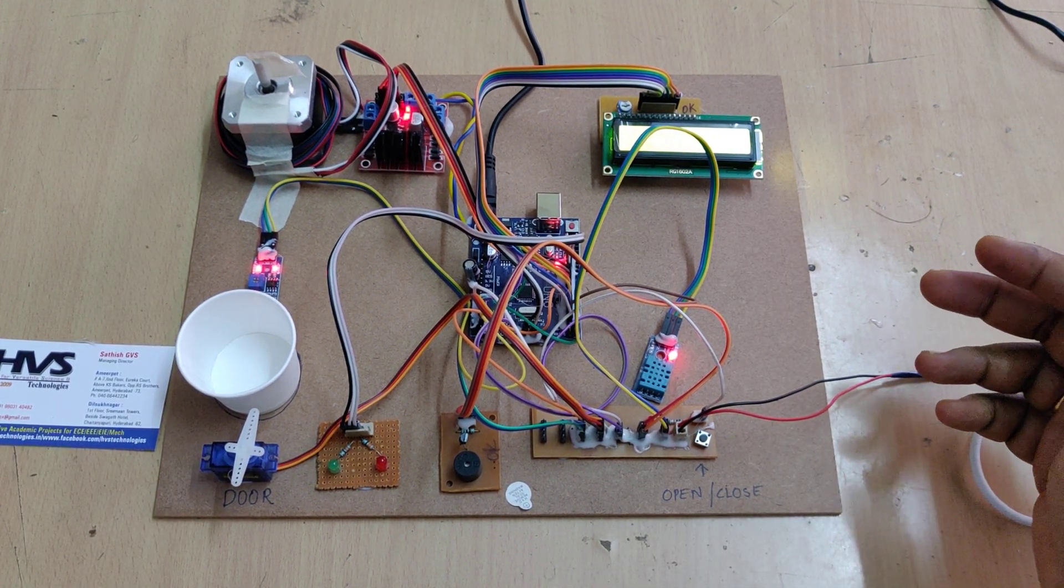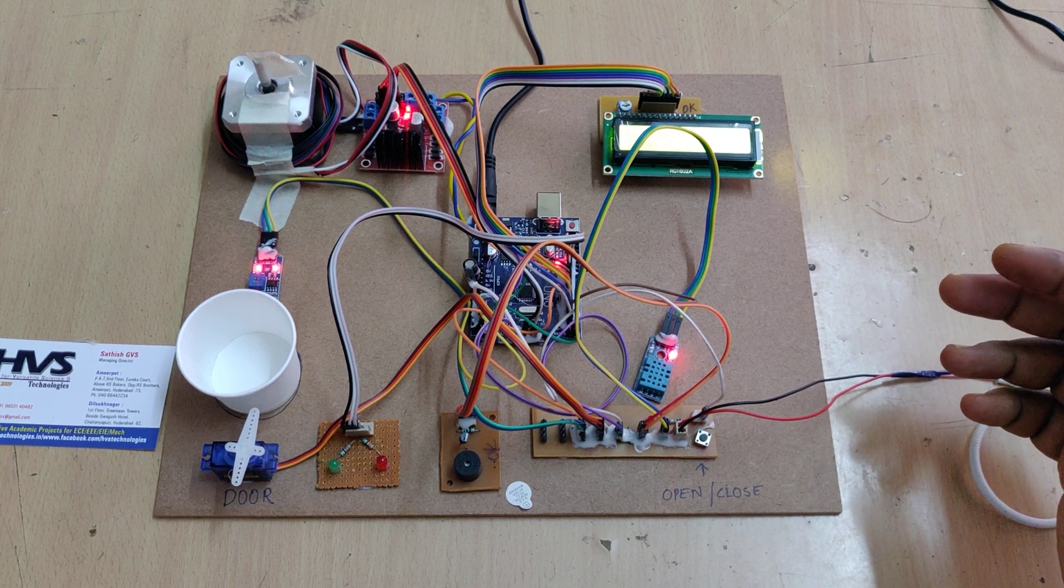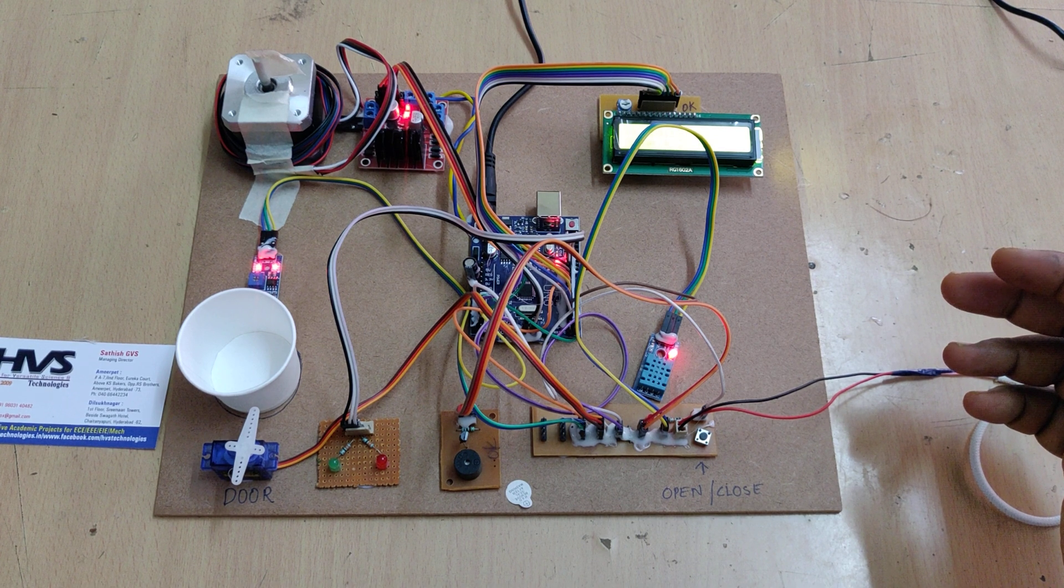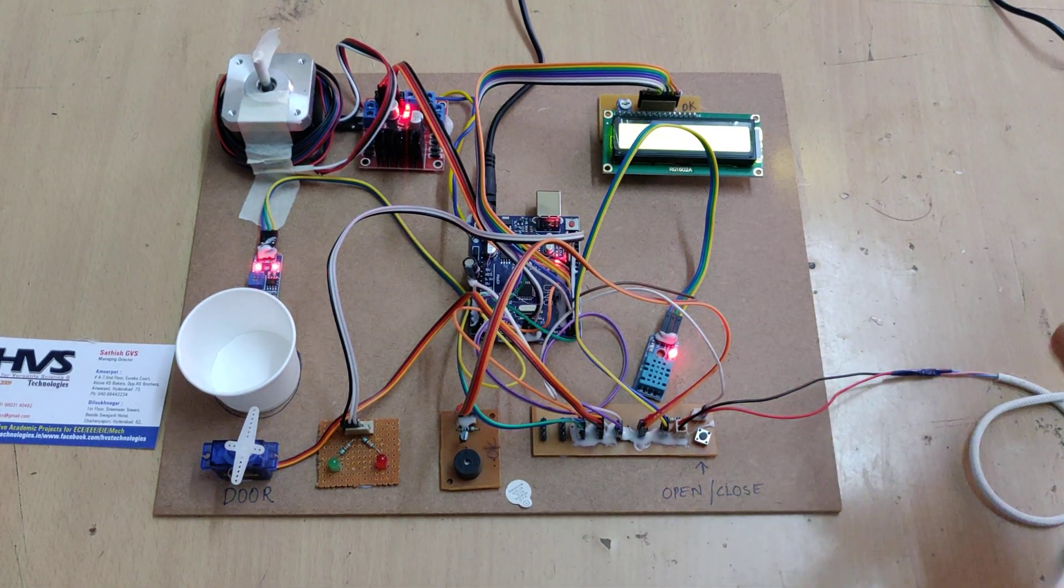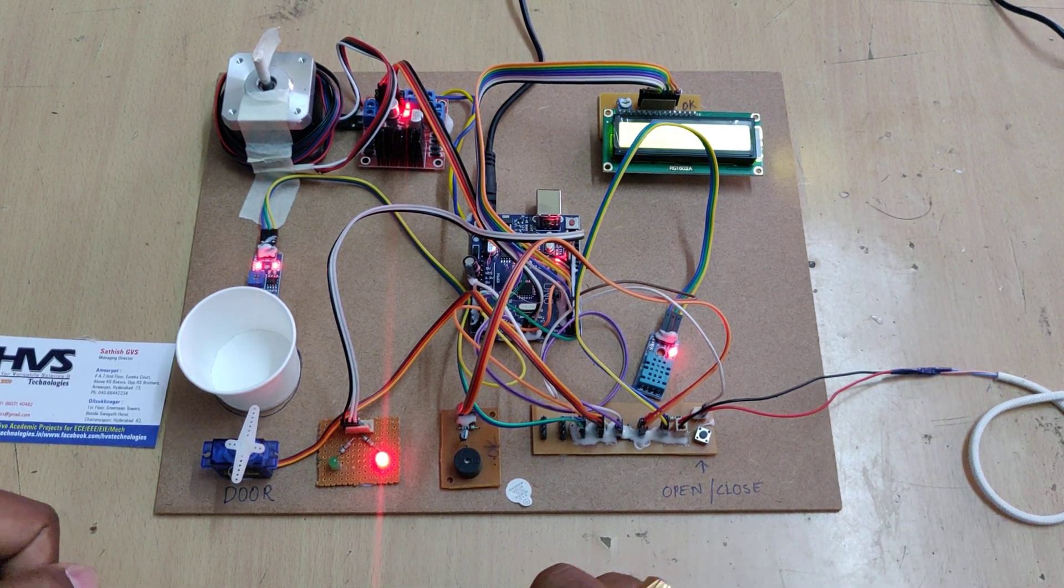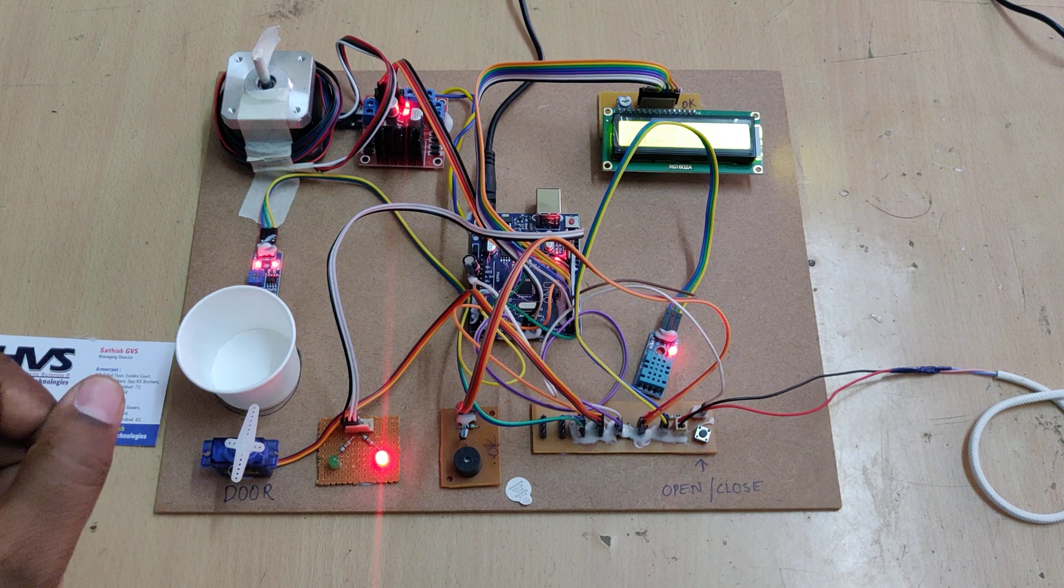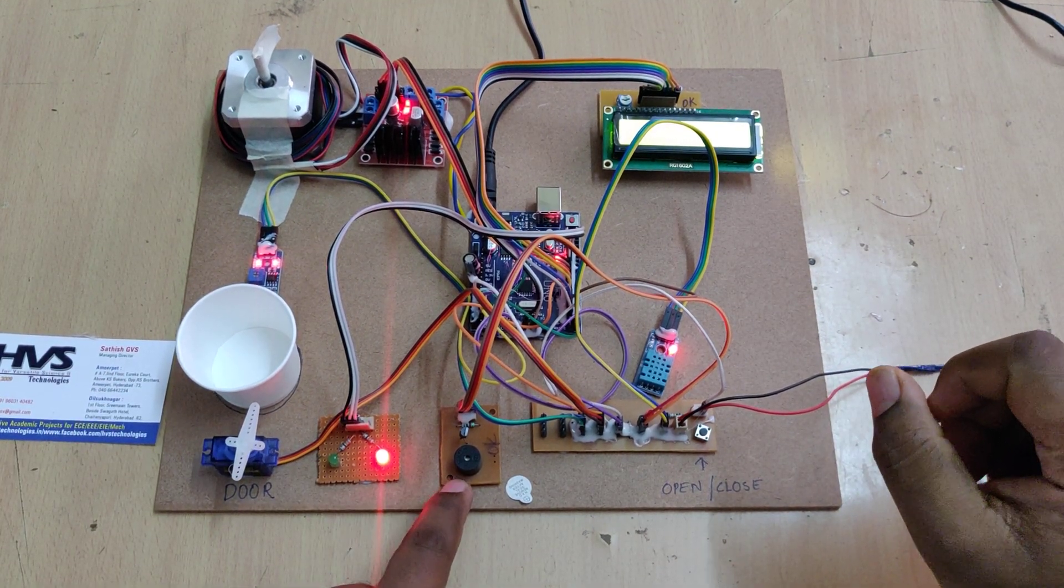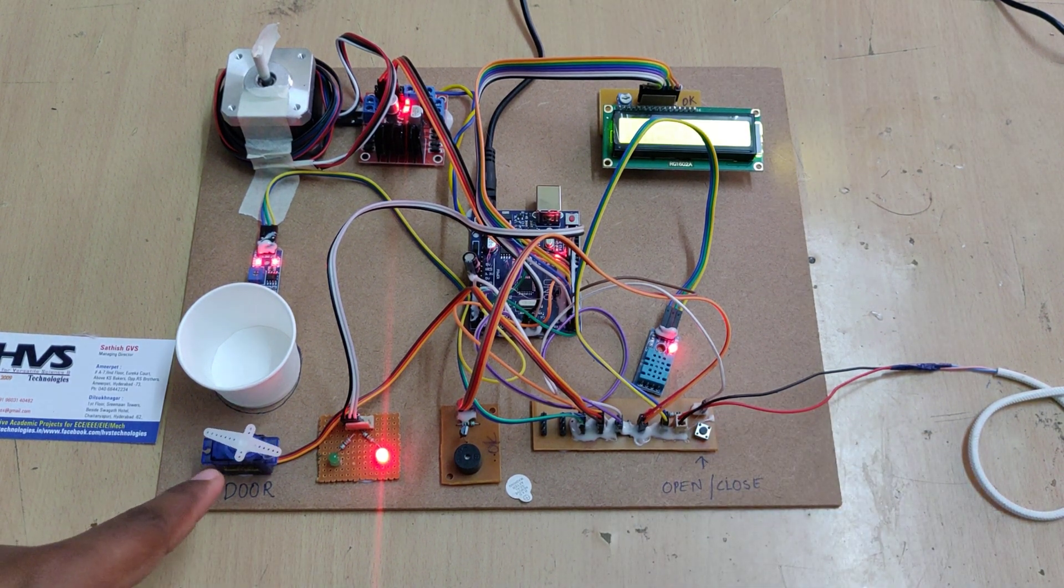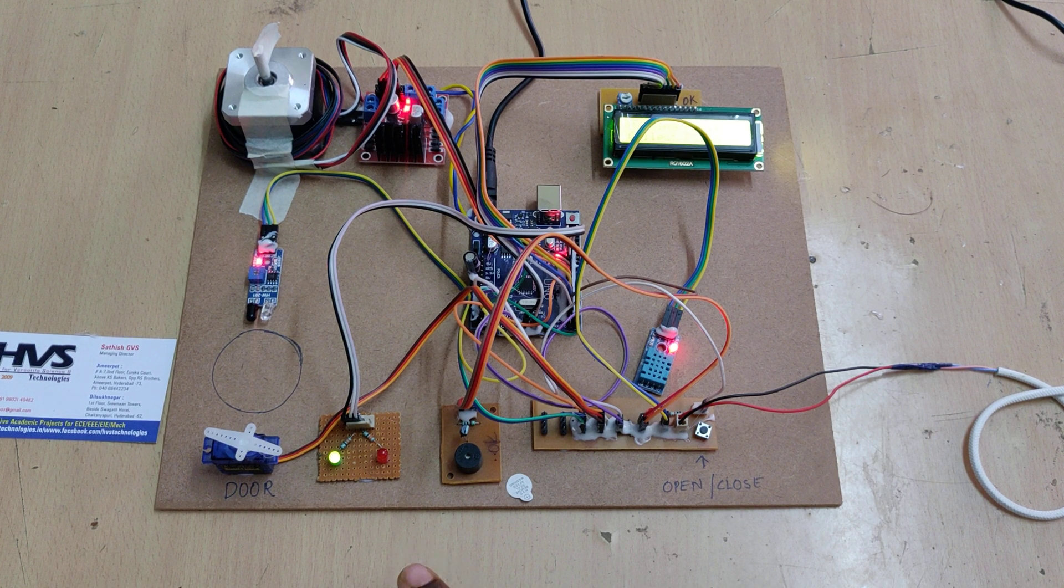The motor rotates and gives buzzer alerts. Till you take the medicine the system keeps on providing the alerts through visual indication as well as audible indication.